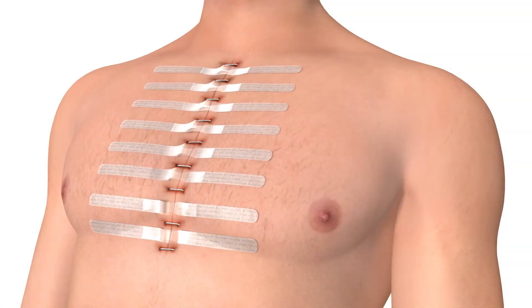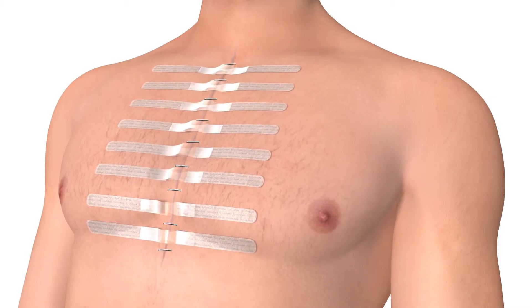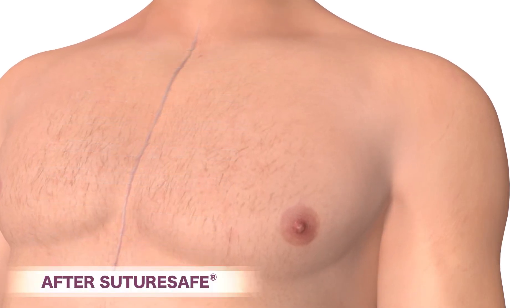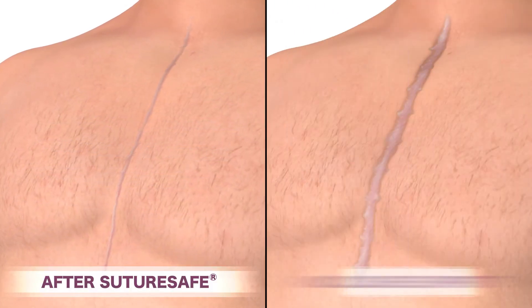Reduced pain encourages patients to be more mobile, thereby improving recovery times. The incision remains under very low or no tension during the healing process, dramatically reducing scar formation.